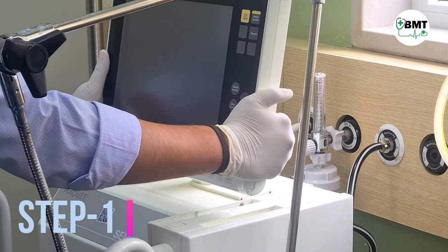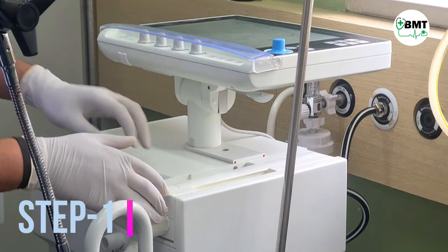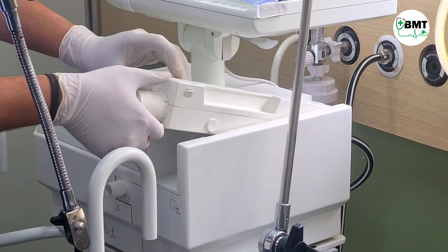Step 1. Wear gloves, make the ventilator off, and remove the expiratory cassette.